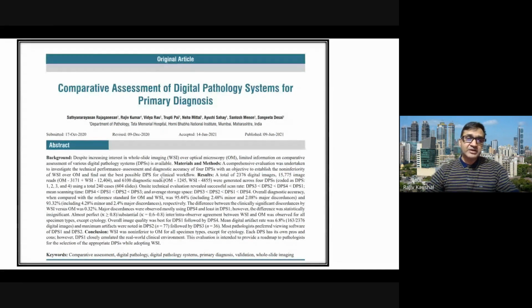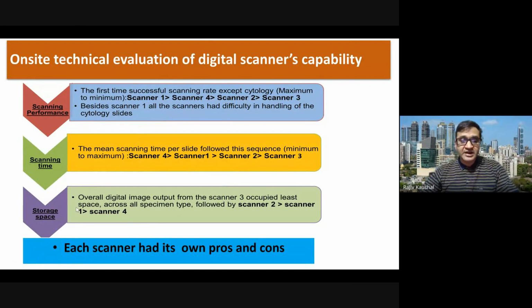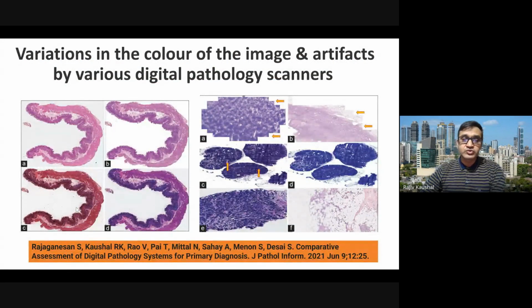So what we have done in our center, before we acquired these scanners, we did a comparative evaluation of various systems, and even published our experience. We found that these are the key components which should be evaluated on site, using your own cases: scanning performance, how much time it takes, and how much storage is taken. There are some pros and cons of each scanner, but it will also help you to choose the scanner which will give you the best possible results.